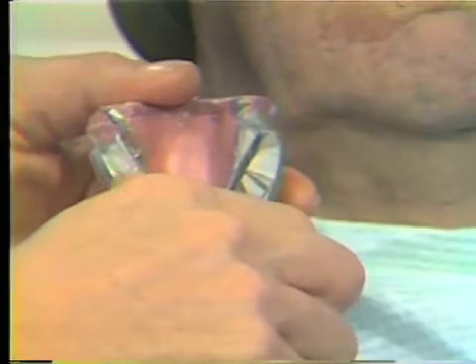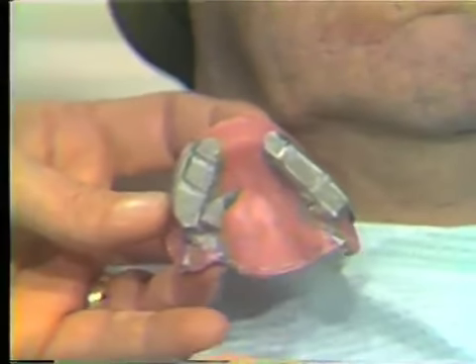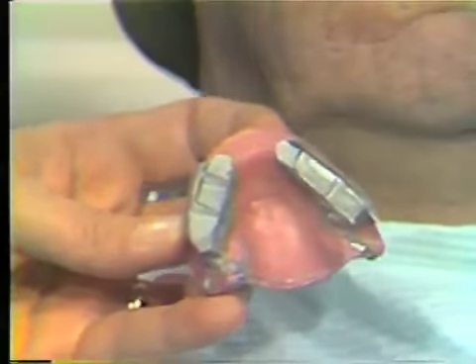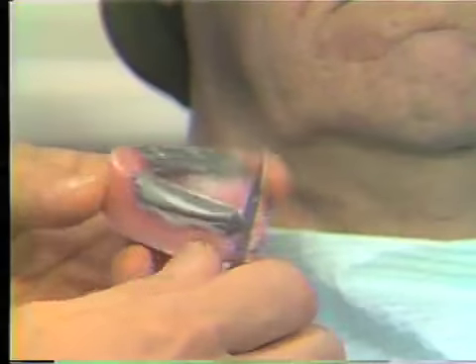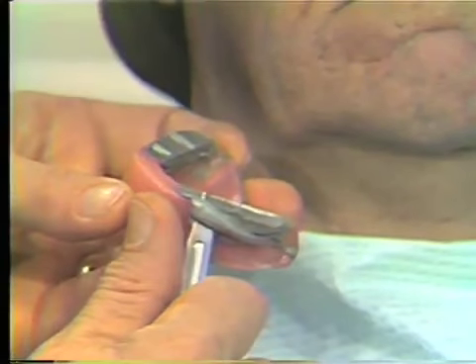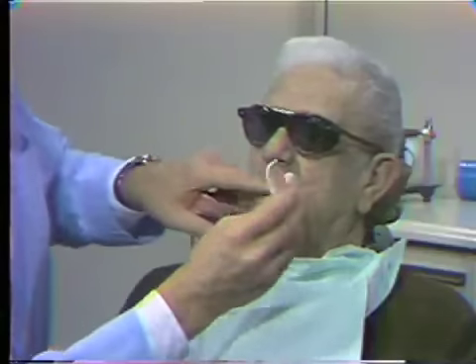Actually, if you allow this to remain, it does guide the patient into a certain position. We don't want to do that. We want to record his position as he comes into it naturally. So we'll get rid of any excess that's on either the lingual or the buccal. Then we'll go back in the mouth again and ensure that he is capable of duplicating this same position. And again, open.